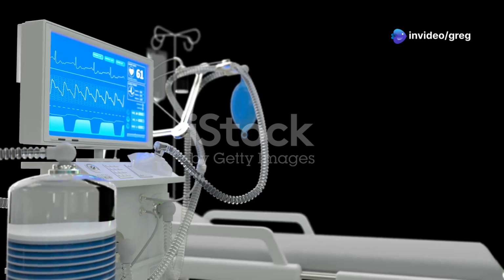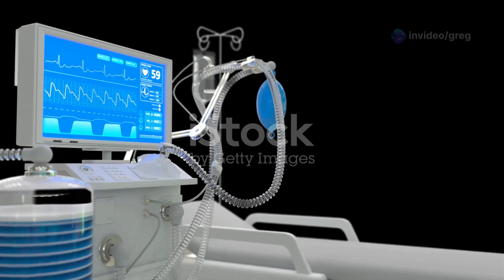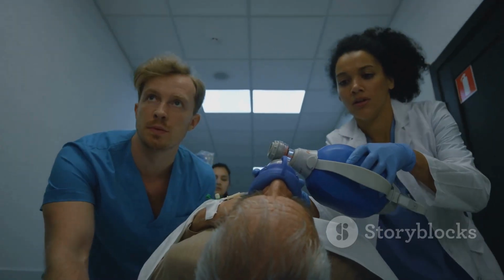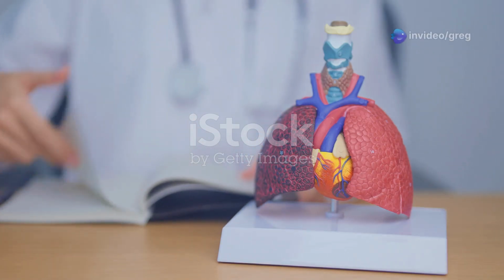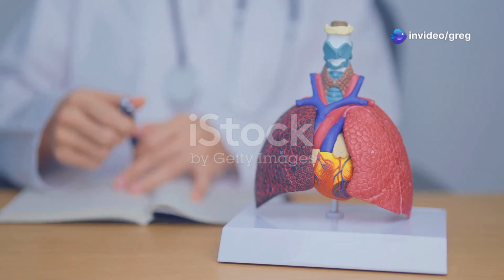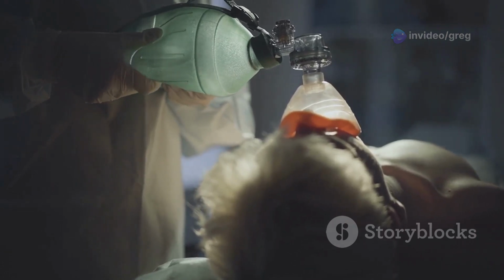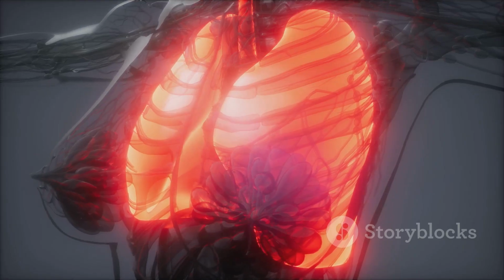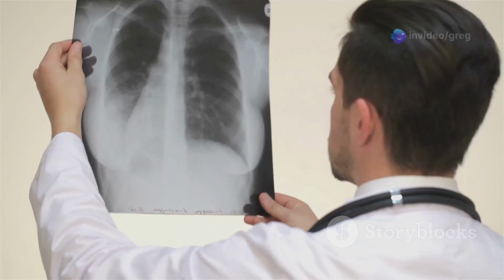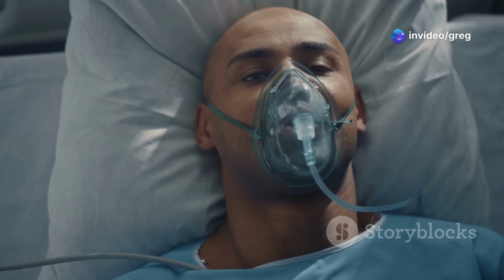Two significant complications associated with mechanical ventilation are volutrauma and barotrauma. Both are caused by excessive pressure in the lungs and can lead to serious consequences. Volutrauma occurs when the lungs are overinflated with too much air volume. This can happen when the tidal volume, the amount of air delivered with each breath, is set too high on the ventilator. Excessive tidal volumes can stretch and damage the alveoli, leading to inflammation and leakage of fluid into the air spaces. This fluid buildup can impair gas exchange and worsen lung function.